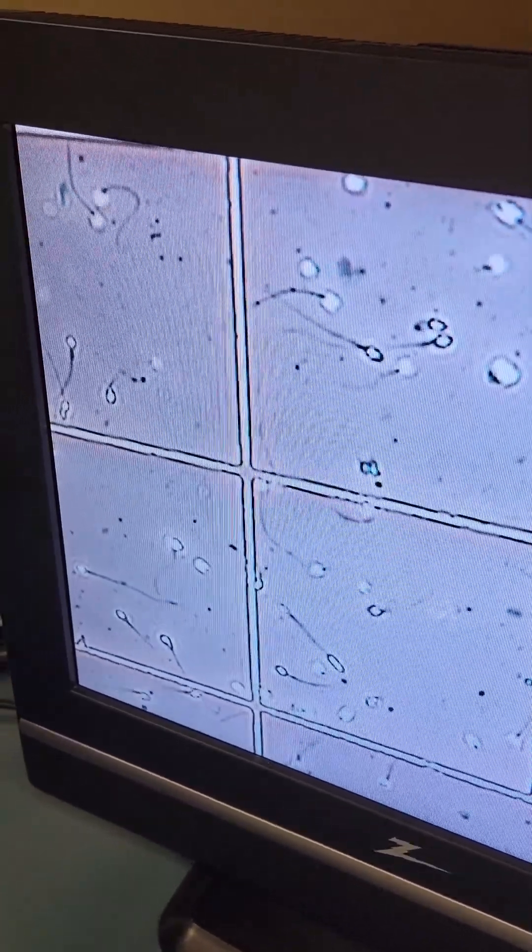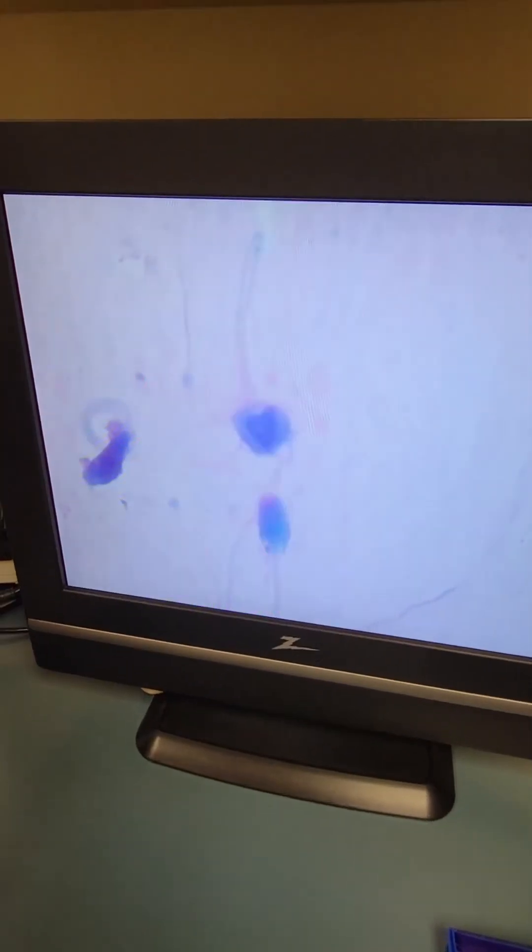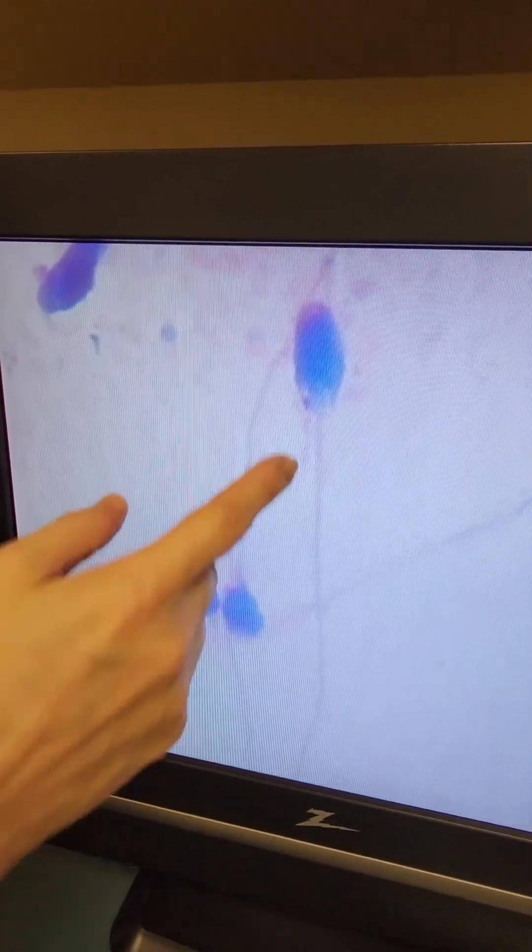Something else we look at is the morphology of your sperm. Remember those slides from earlier? We stain them so that we can get a better view of the shape of your sperm, specifically to see if the head, neck, and tail are normal. And that's it for the analysis part. Once that's done, the doctor will review the findings and discuss them with you.